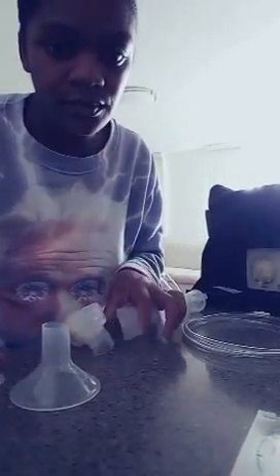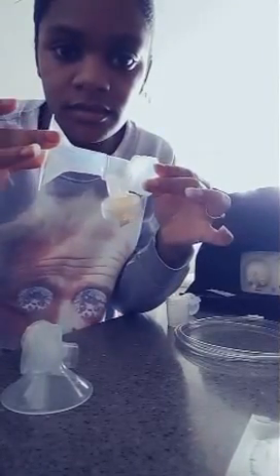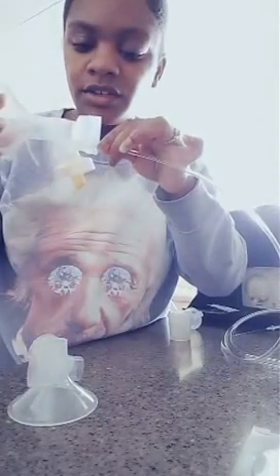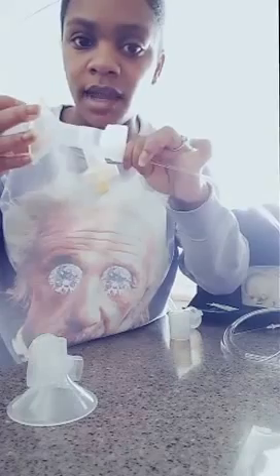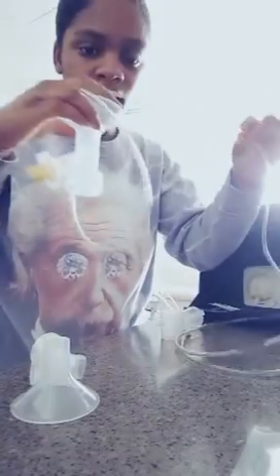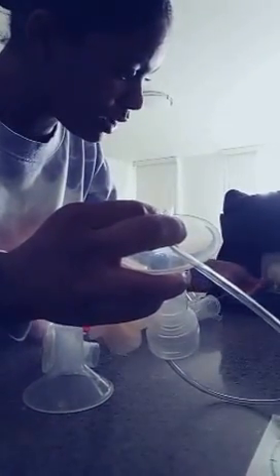So the first thing that I do is connect the shield to the connector. So it's really simple. Connect like so. Then you take your tubing, connect to the back of the connector. There should be a little insert in the back that allows you to easily insert the tubing. And you see, now it's all connected. Then from there, you connect your tubing to your pump.